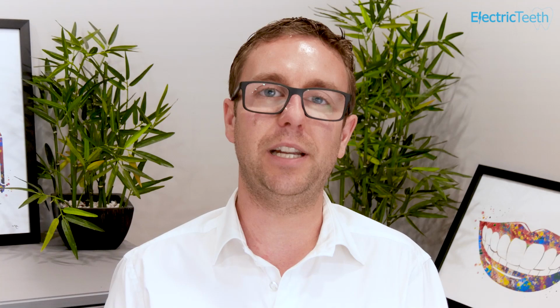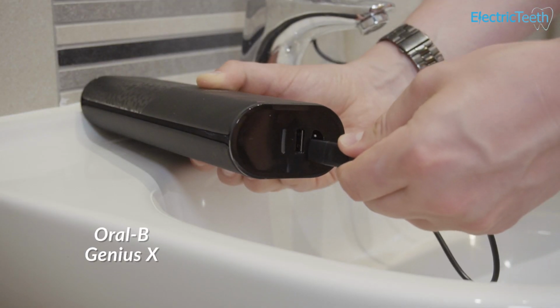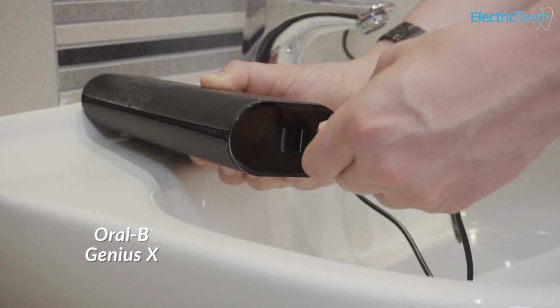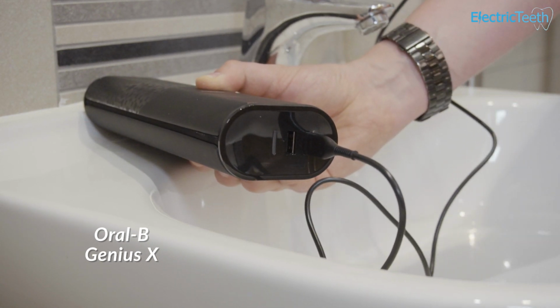And then from the case, you can connect a USB cable to charge your smartphone at the same time as you're charging your toothbrush, for example. It's quite clever, but the perception of the USB port on the travel case is often misunderstood. You can't charge USB devices from the case itself unless you've got the proprietary power adapter for the case attached.